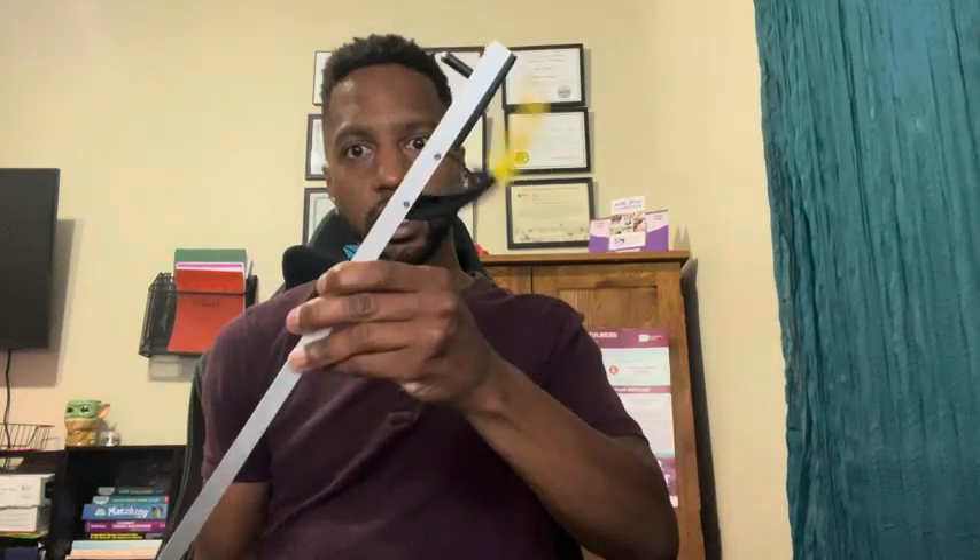The whole idea of this is that you pull on the trigger here — it's very, very light. You pull with your two fingers and it will cause the other end of the reacher to open and close.